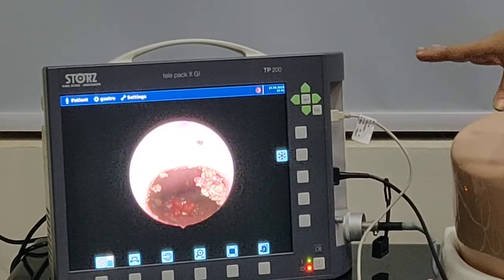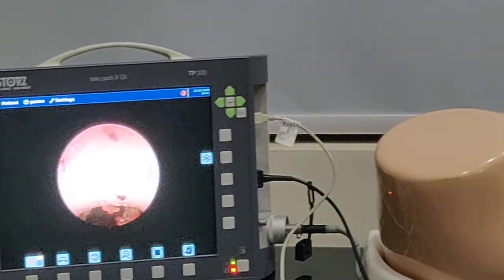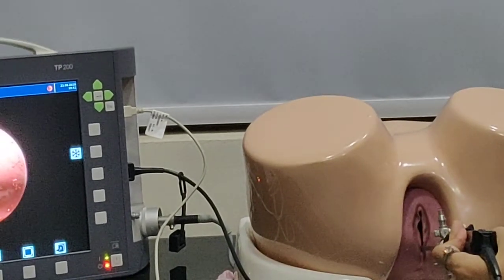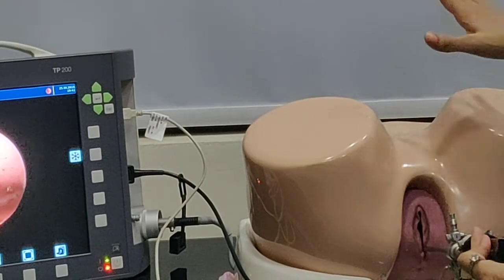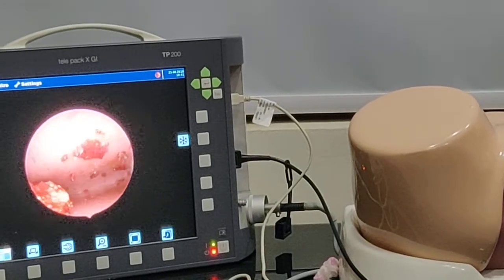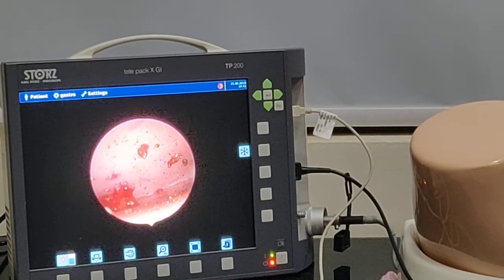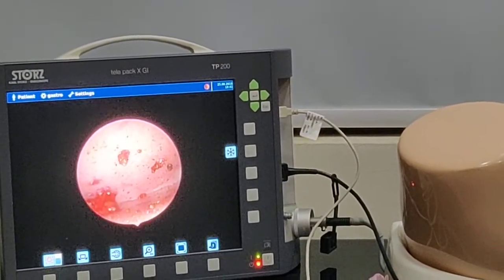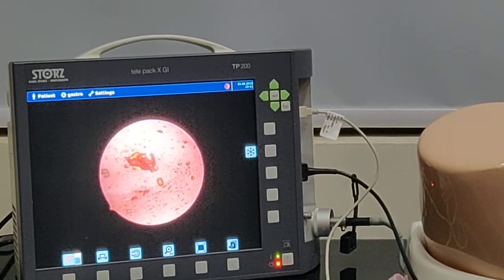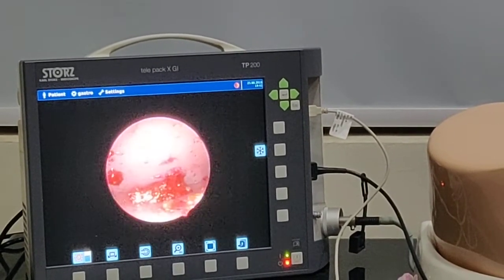Now we have reached the level of the isthmus, and you can see the isthmus is like this. We can simply rotate the light cable to 90 degrees and go inside easily. Once inside the uterine cavity, we can see some polyps. Then we go further inside to visualize both the ostia. Using the 30-degree scope, we simply rotate the light cable to one end to see the left ostium, and then rotate the light cable to the opposite side to see the right ostium.